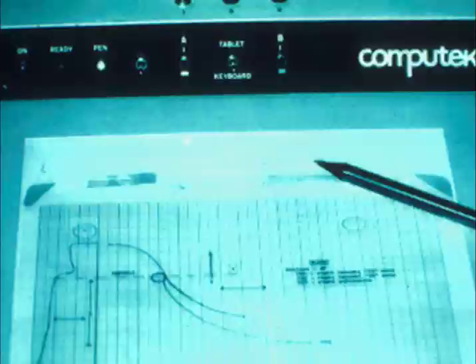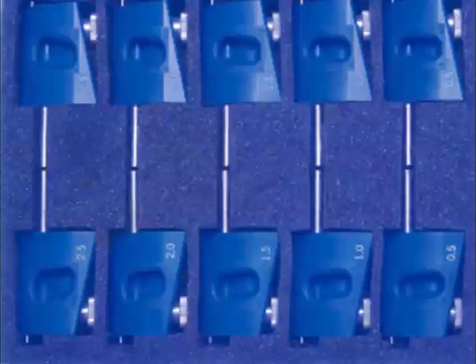What they did is took all these movements and put them into a computer to come up with statistical averages of actual patients' jaw movements, which led to the development of 5 different size motion analogs, ranging from 0.5 to 2.5 in half-millimeter increments.